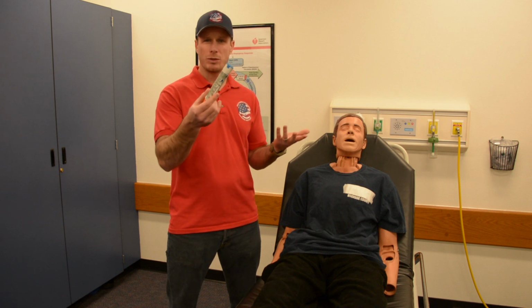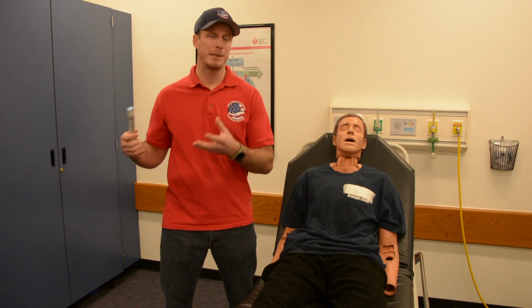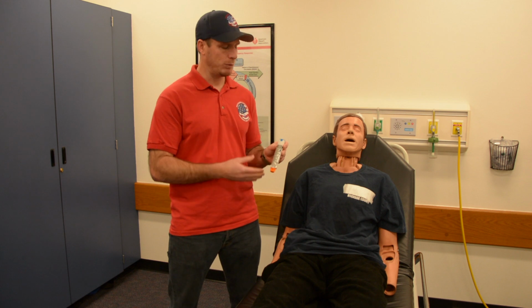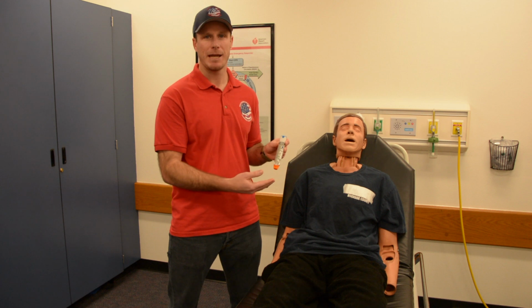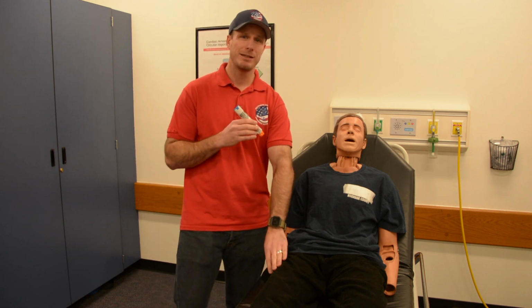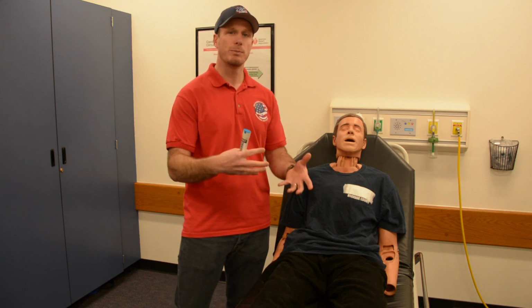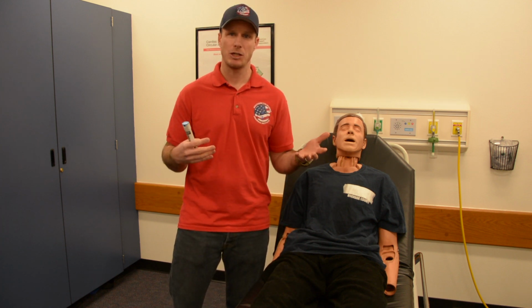Our epinephrine comes in two doses. Specifically, it either comes for an adult, where it comes in 0.3 milligrams, or for pediatrics at 0.15 milligrams. You won't get to decide. It will either be coming as maybe an EpiPen or maybe an EpiPen Junior for the pediatric dose. This is an intramuscular drug, which means it's going to be injected into the muscle, and we go into the outer side of the thigh, known as the vastus lateralis. We're going to hold it in there and allow all that medication to distribute into the muscle, and we're going to massage the muscle afterwards to help distribute the medication.